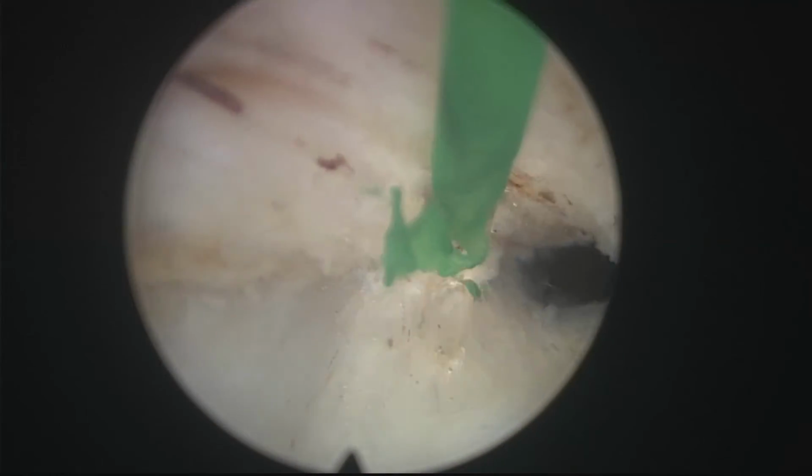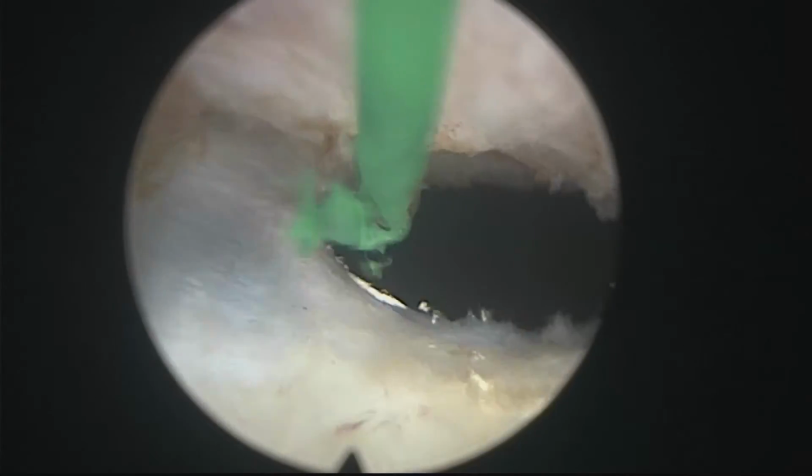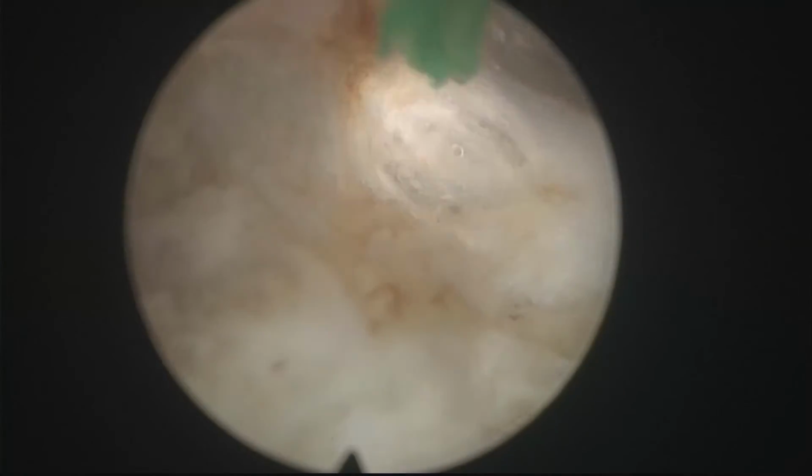Usually it has no consequence to go a little bit deep in a region of the capsule. It's important to stop in time so you don't do a massive perforation, in which case probably it's better to put a catheter and come back another day. But here we are progressing.